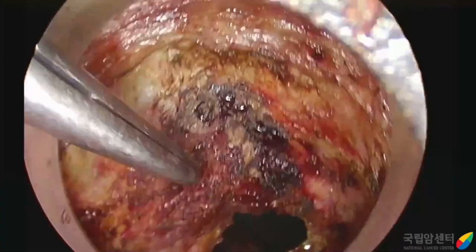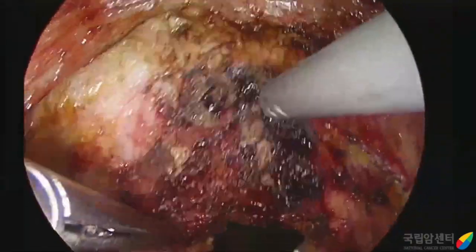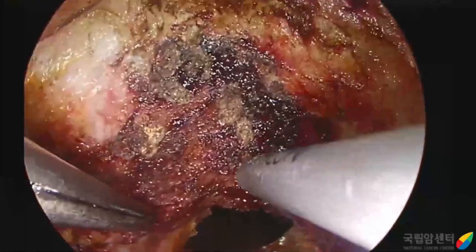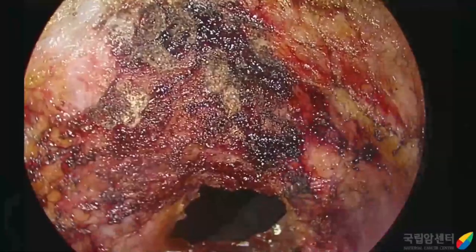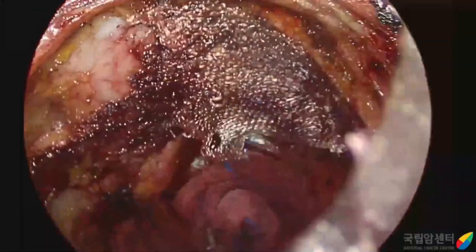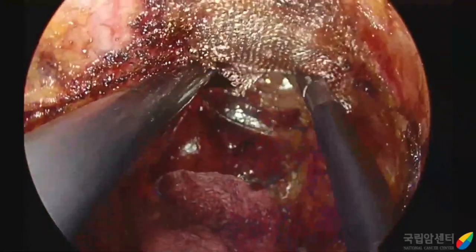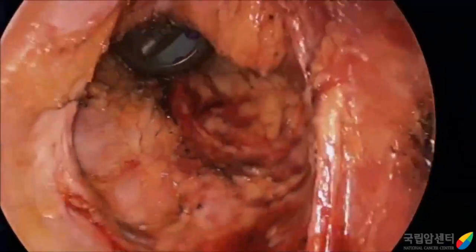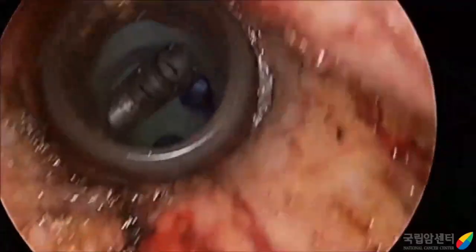This is the final view from the anus after completion of TME. We can clearly see the prostate. From the abdominal view, we can see that total mesorectal excision was completed clearly.